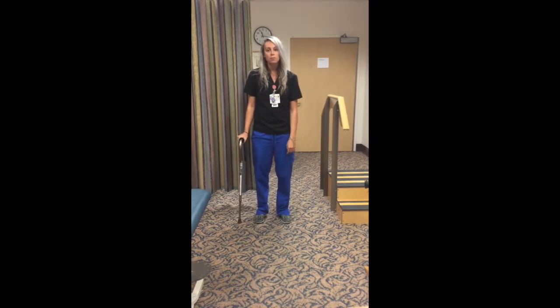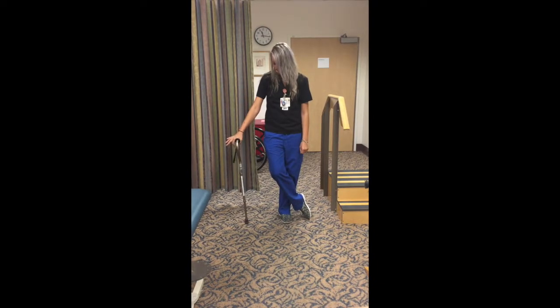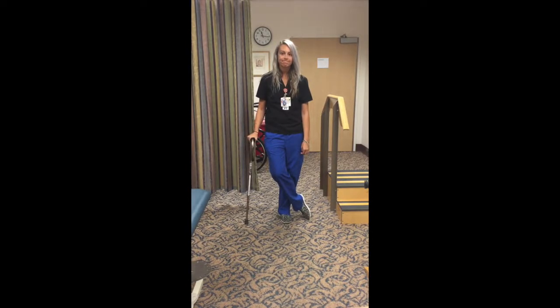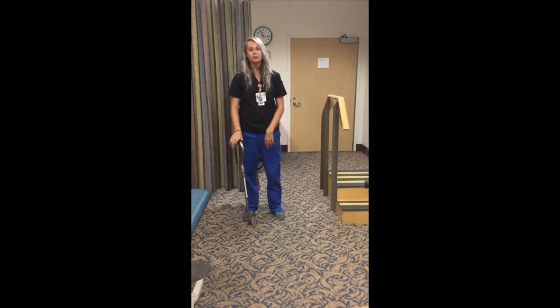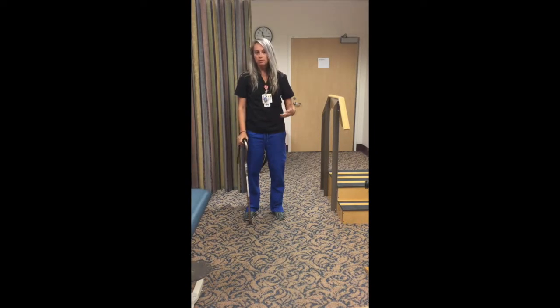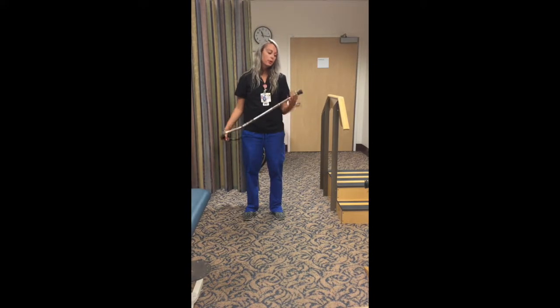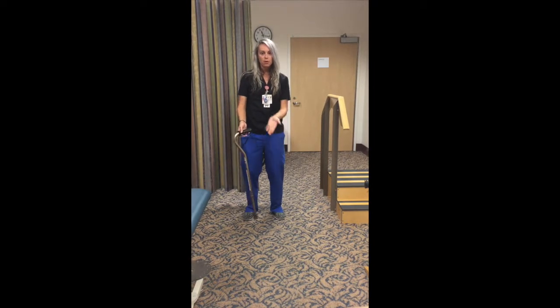Great. I have 2 more questions about the cane. So that's a pretty standard cane. A lot of patients ask us about the 3-pronged or 4-pronged cane. Does any of that make a difference? It does make a difference. So for orthopedic surgeries, especially if you weren't using anything prior to surgery, you don't have any past medical history of the need to use a 4-prong cane, a single point cane is going to be the most effective and make you the most mobile because it's designed to hopefully get you off of it.